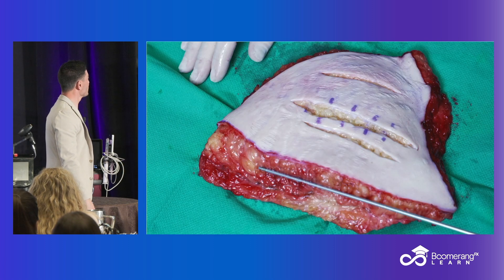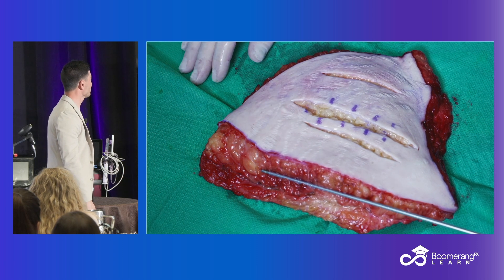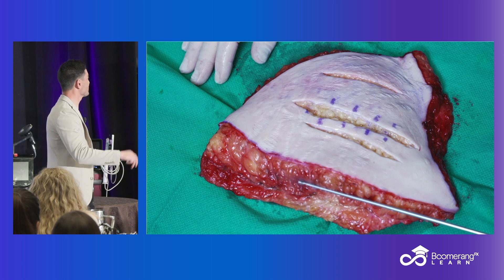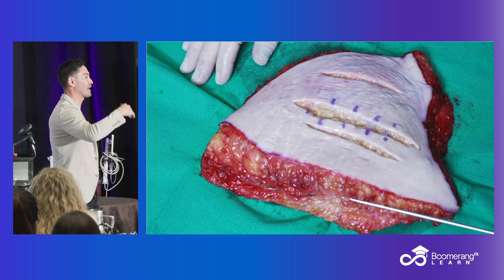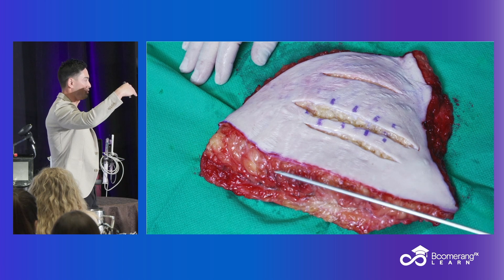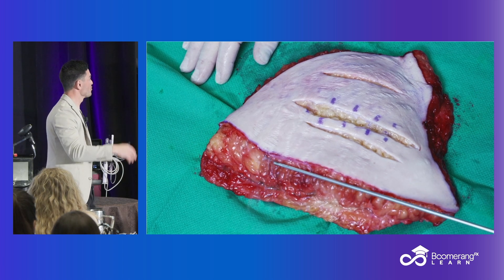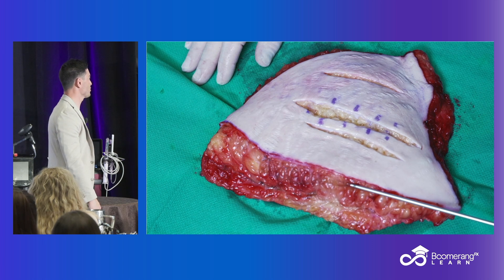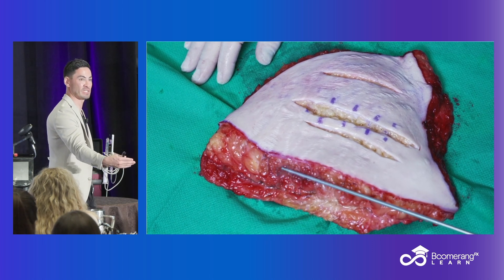All we're doing is no tumescent — this is directly into the subcutaneous space. It's frequent pops of RF back and forth at desired tissue levels, through a small insertion site. We go right up underneath the dermis, all the way down to muscle and everything in between. So it's like a very, very deep Morpheus.